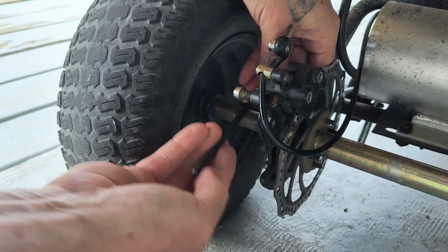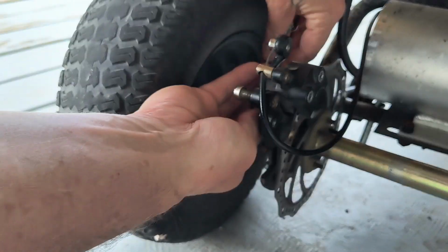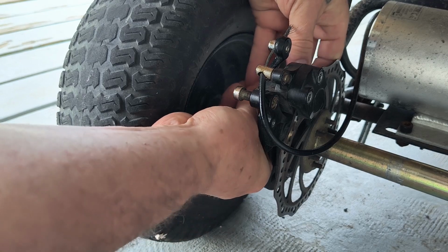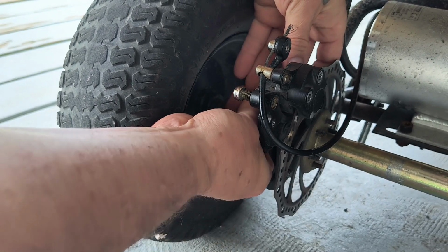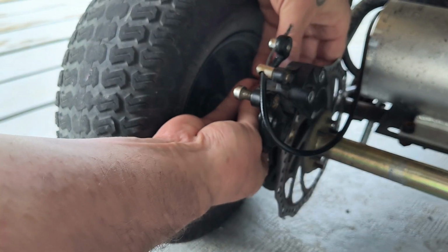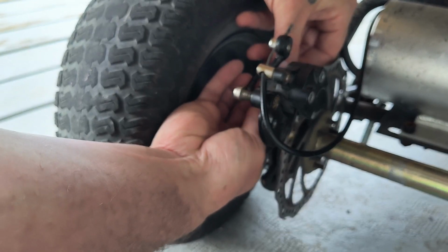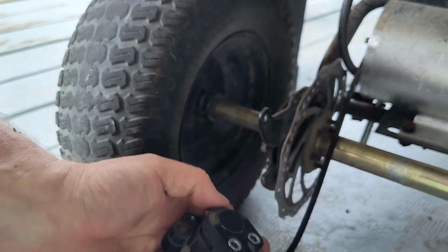I'll get these two undone and show you a disconnect, and then I'll stop for a while until anything interesting happens. I know it's supposed to be a mechanical weekend, but this is on a Friday. And I'm going to need to go out on this thing in the next couple of days. I'd prefer to get it running properly before, well, I'd prefer my ability to stop before I go doing anything on it. There we go. Disconnected.